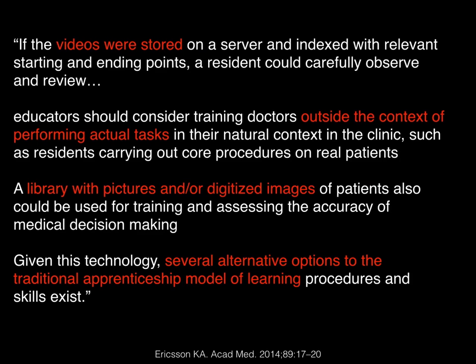Ericsson, who you remember from talking about proficiency and mastery learning, goes back to ask how mastery learning and expert performance could be improved. What if we had videos that were stored somewhere that you could review? What if we could pull that training out of the context of actual tasks, meaning instead of training you while seeing patients, we have another way to do that, such as simulation?